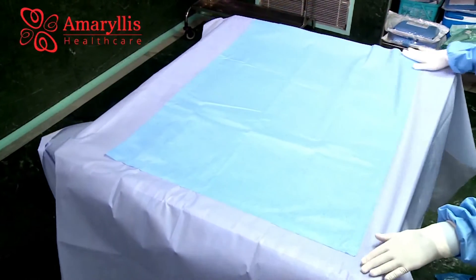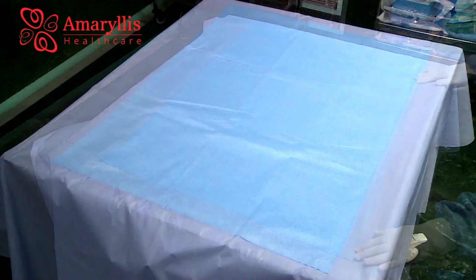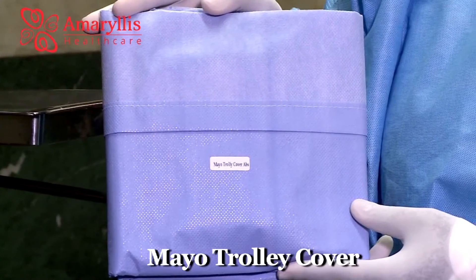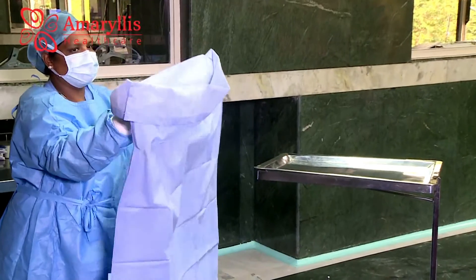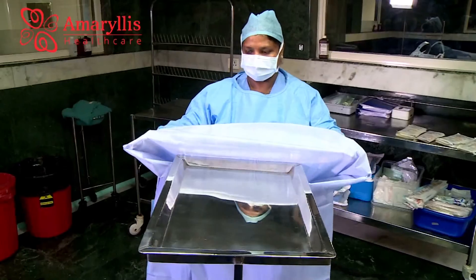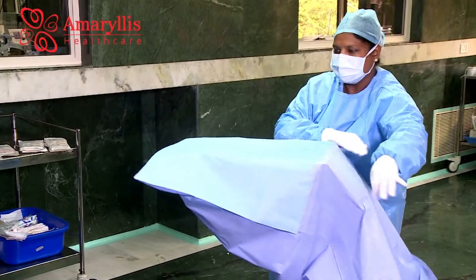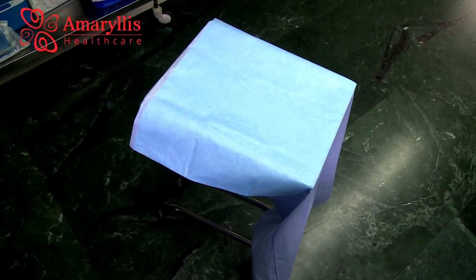The absorbent layer limits spill out, thereby offering better sterility. The mayo trolley cover is used to cover the mayo trolley, with its absorbent layer also limiting spill out and offering better sterility.